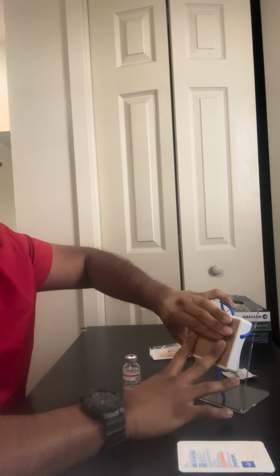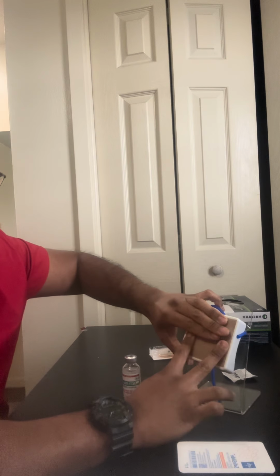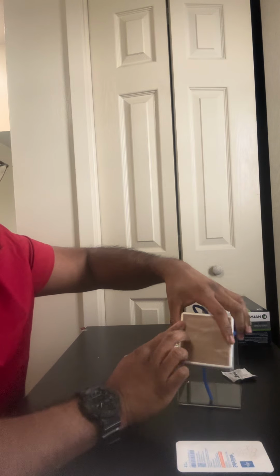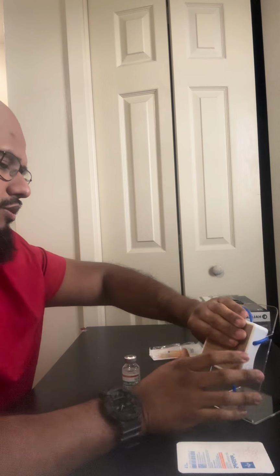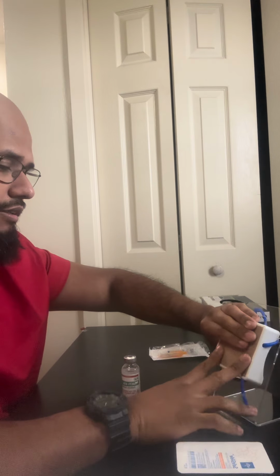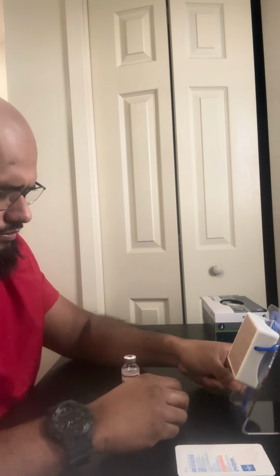Typically it's around right here, because you have to get the skin taut, kind of like a Z-track pattern. You want that skin to be really tight. You want it really tight when you do IM injections. You want to make sure you hit the muscle, not the vessels. Anyway, so I've got the medication.